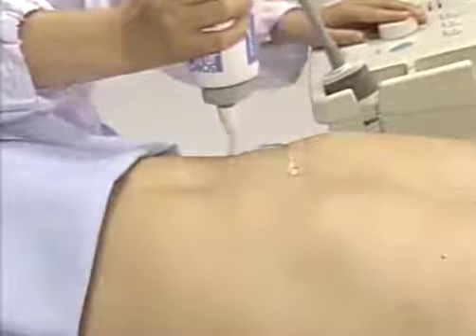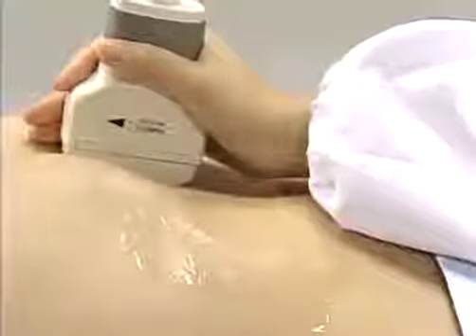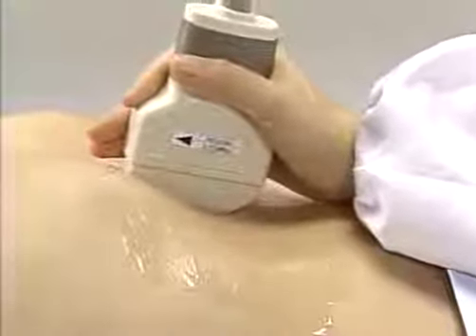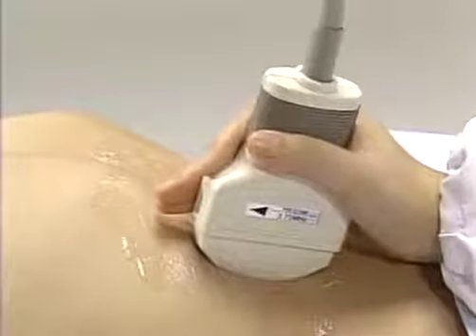Next, apply acoustic jelly to the epigastric area and spread it all over the abdomen. Jelly prevents air from entering between the skin and probe. When the examination is prolonged and the scanning room is dry, the jelly dries up and images become unclear. If this happens, apply jelly again.